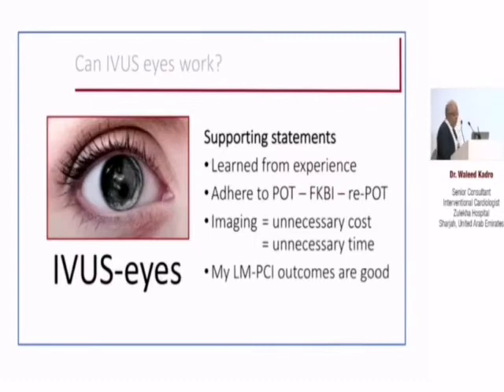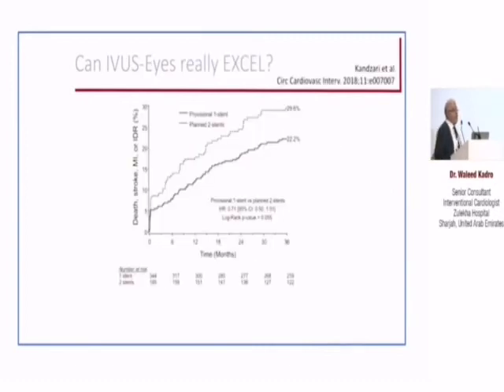Now, those are the points. Now, can IVUS really happen? Let's look at the EXCEL study. This is the study from EXCEL done by David Kandzari, comparing using one stent or two stents, and you see the difference in the outcome.